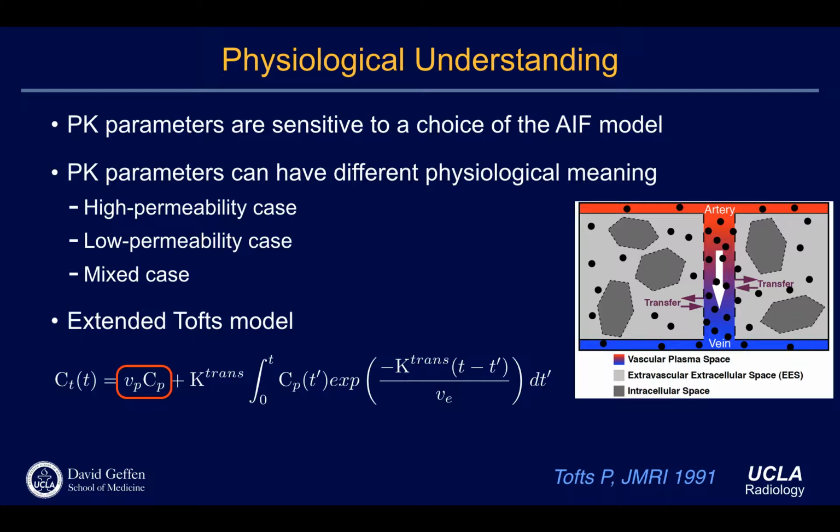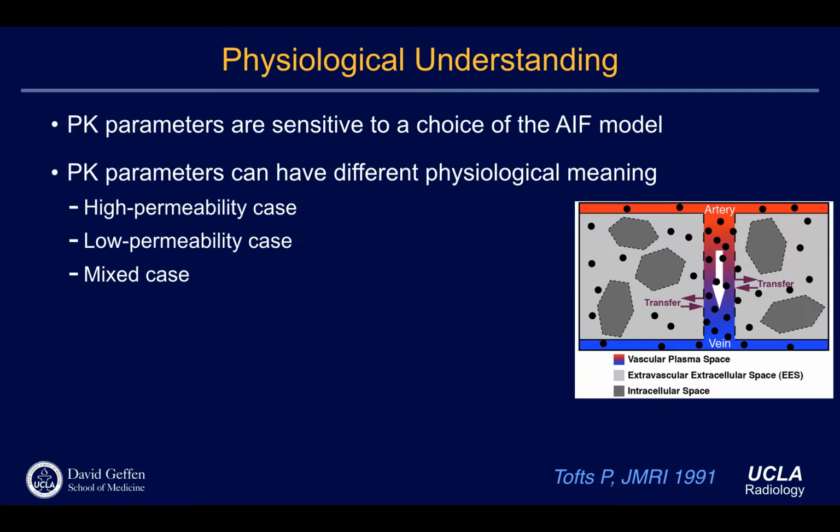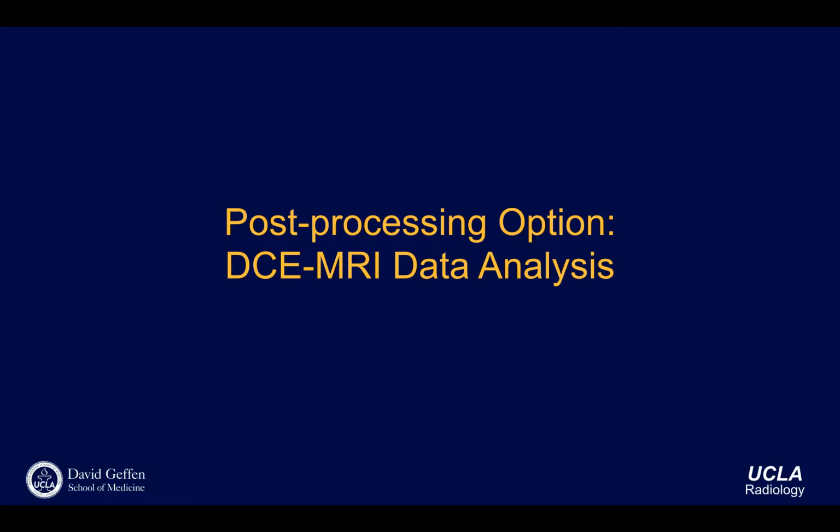Part of the reason is, again, it's not perfectly looking at the perfusion or the flow information only, because it actually includes other information together. So in some situations it may not be matching really perfectly. Okay? All right, so this section is basically showing a summary of all the quantitative MRI procedure. As you can see, this is very complex, right?